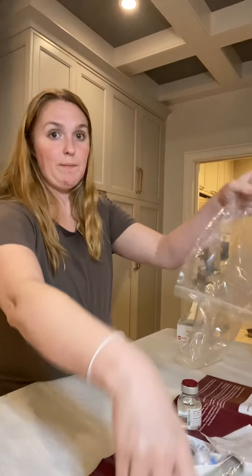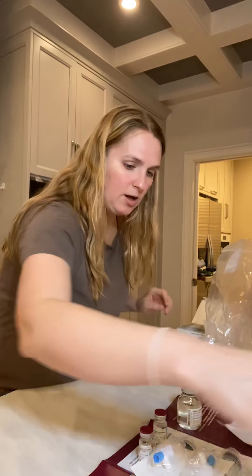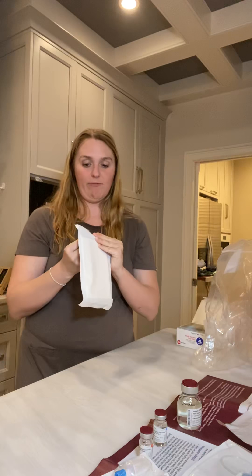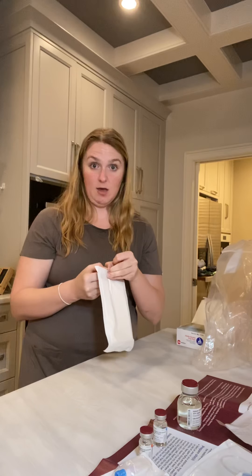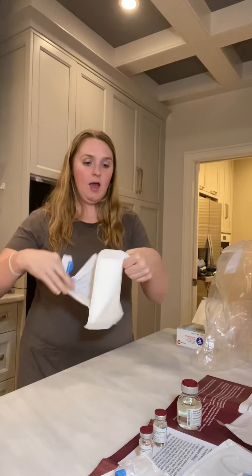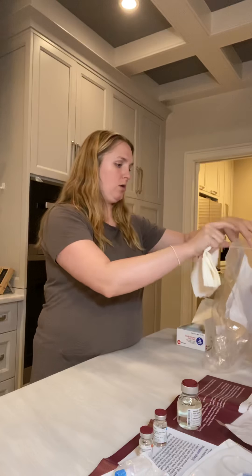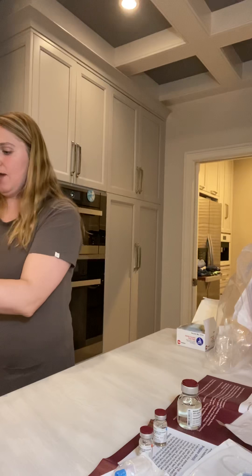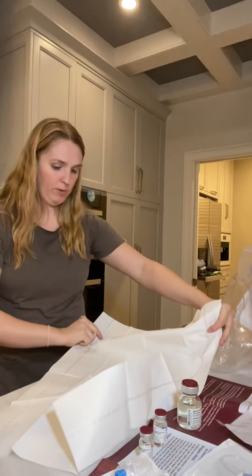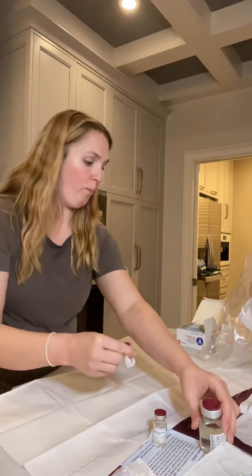Dump everything out onto the pad and I'll show it to you as I get to it. The first thing you want to open is your sterile pad. Everything that is going to touch my body will first go onto this sterile pad. I don't actually open anything anywhere except directly onto this pad because it has no germs, no bacteria — nothing. The only things that could get on it are what's on my hands, which I've already washed.